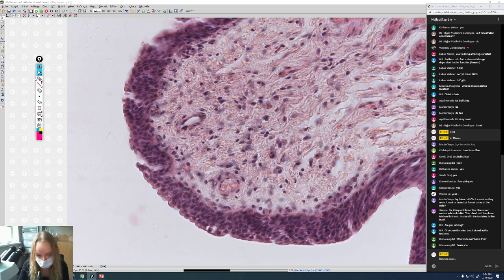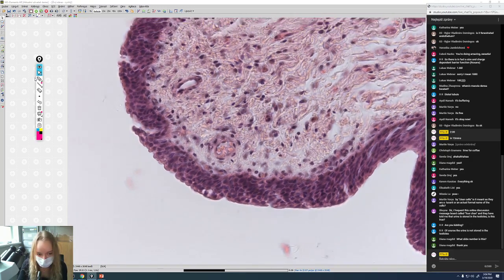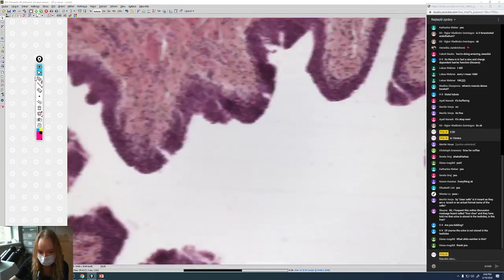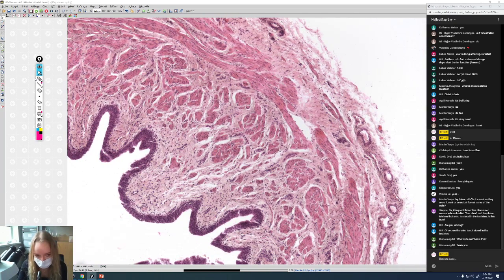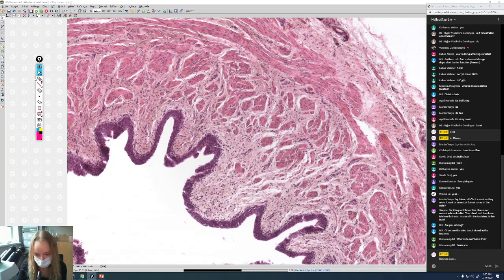The epithelium is kind of different, but it's typical for the urinary system. So yeah, that's all. What about the muscularis? It has some parts. You know from the digestive system that the first layer, which is close to the mucosa or submucosa, is circular.